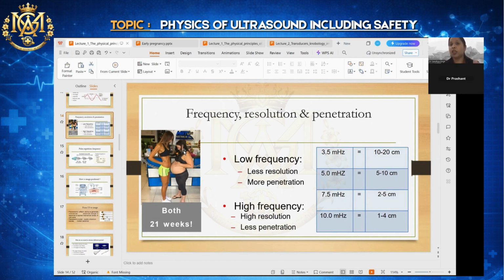That's all. Now, but if that patient has not come for a growth scan, she has come for a Doppler scan. Now you have to do umbilical artery Doppler, uterine artery Doppler. You will choose that mode. How to choose the mode, I will teach you in the next class. But first of all, you should know these many modes are there and you have to choose as per your choice. In early pregnancy, you just need your B mode.